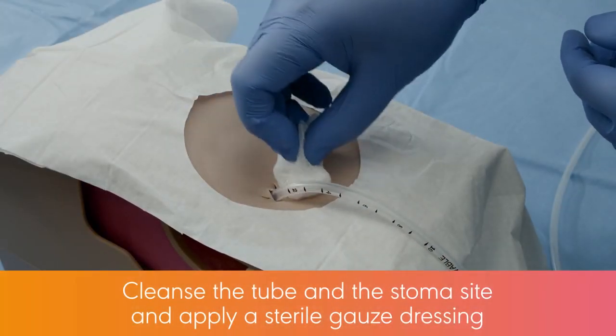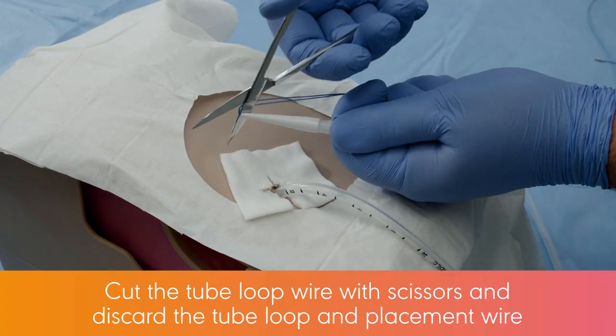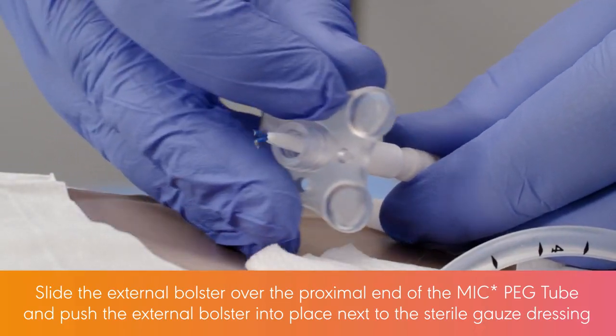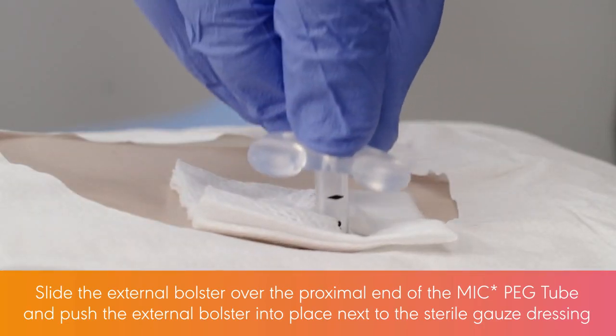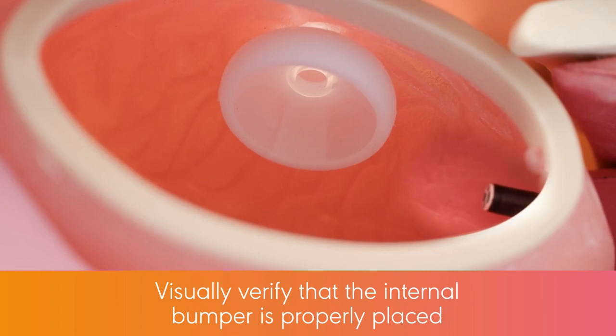Cleanse the tube and the stoma site and apply a sterile gauze dressing. Cut the tube loop wire with scissors and discard the tube loop and placement wire. Slide the external bolster over the proximal end of the MIC-PEG tube and push the external bolster into place next to the sterile gauze dressing. Visually verify that the internal bumper is properly placed.